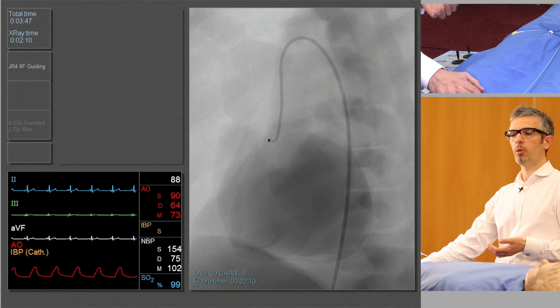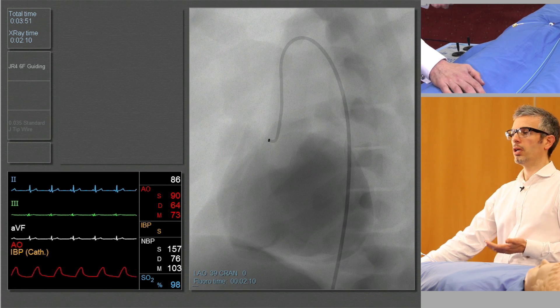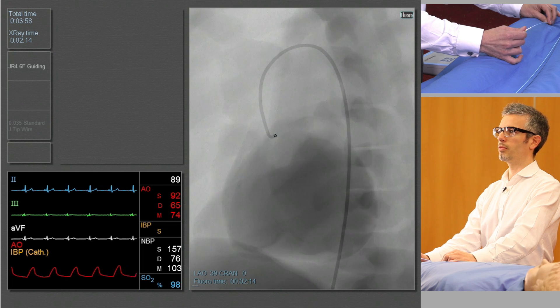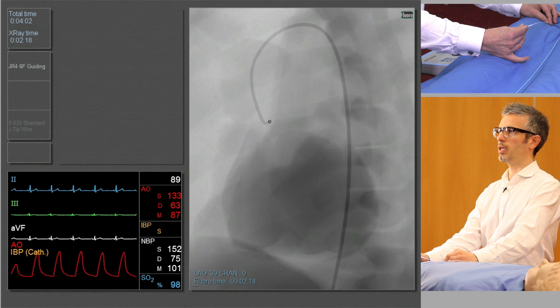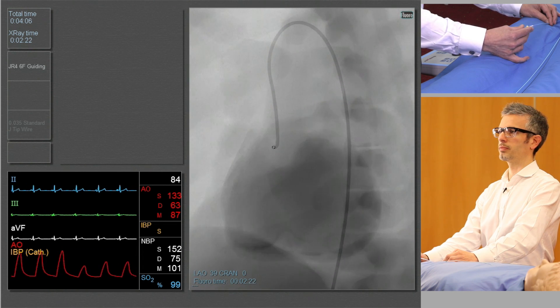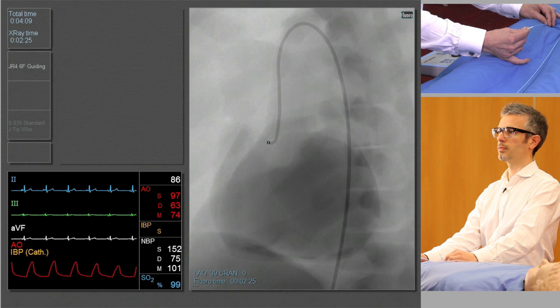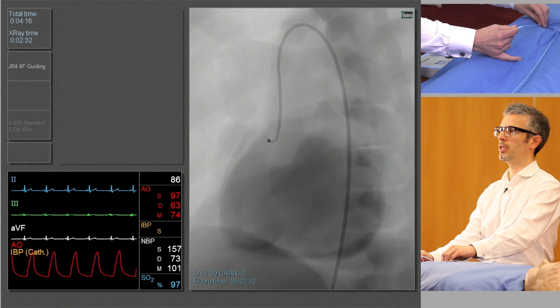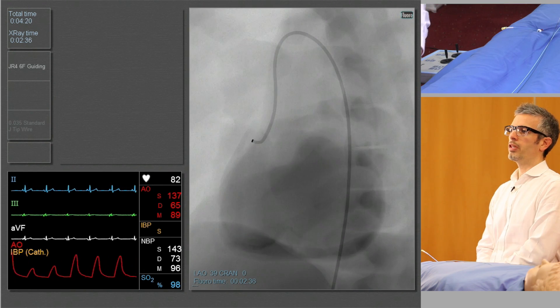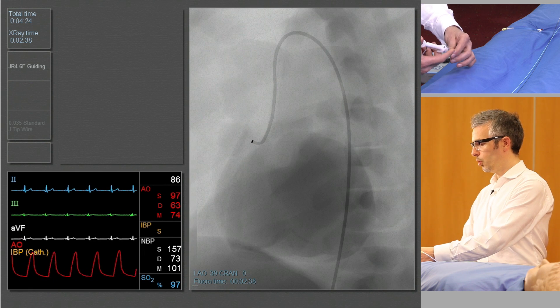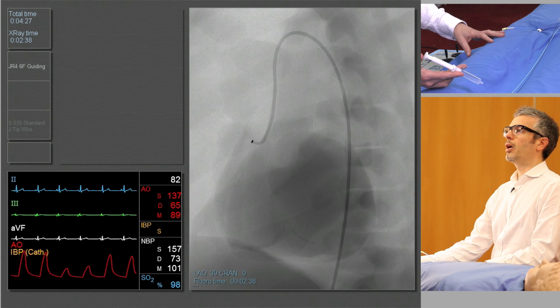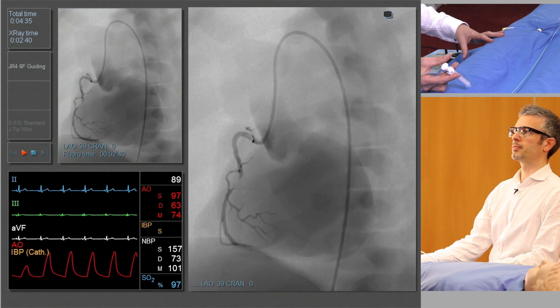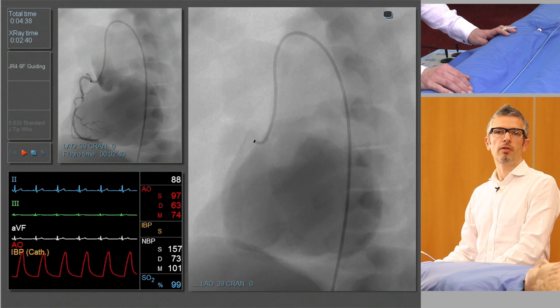The conus branch is an early branch of the right coronary artery and sometimes the catheter tip can enter that branch — and it's generally not a good idea to inject if it's in the conus. So I'm just going to take some torque off. You can see our pressure tracing change there again. I'll just try to re-engage in a slightly different orientation. Just a little bit of manipulation to take that in, and you can see it jump right across there — and this time when we look at the pressure tracing it's a normal, non-damped tracing. One last check to make sure my pressure is okay, and we take the cine run. And that's catheterization of the right coronary artery.